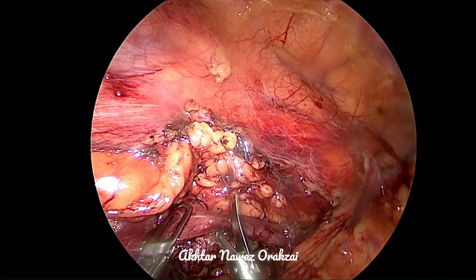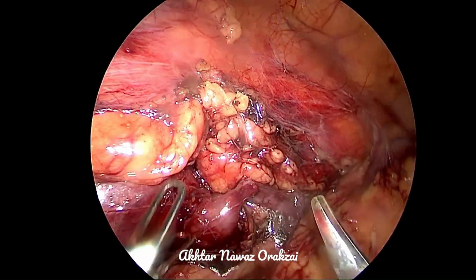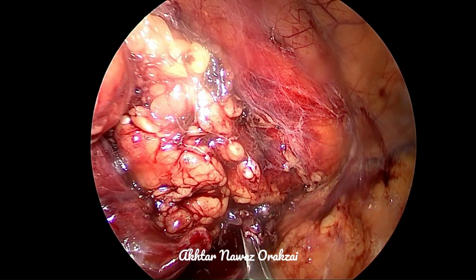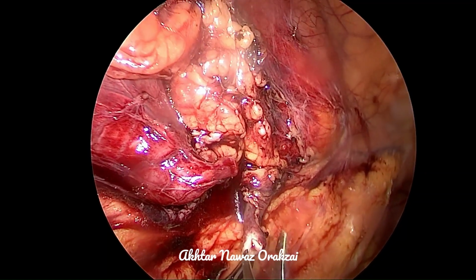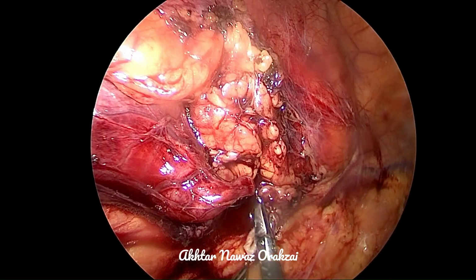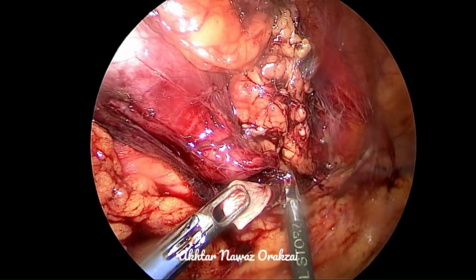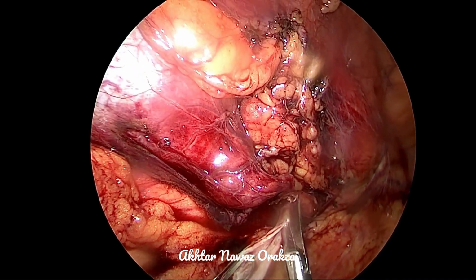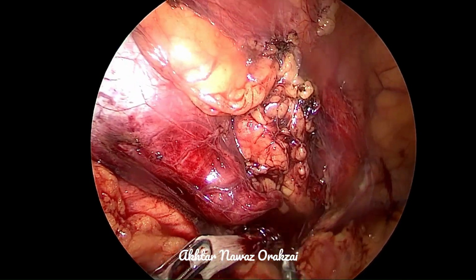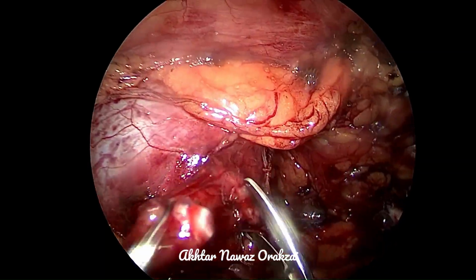Now, the most satisfying moment for me while I am performing a pyeloplasty, whether open or laparoscopic, is that when I transect the ureter, none of the urine comes out of the pelvis. That is a very satisfying feeling for me, which means that our diagnosis is correct, and the segment which is obstructed is identified. And then we make a spatulation on the lateral aspect of the ureter.